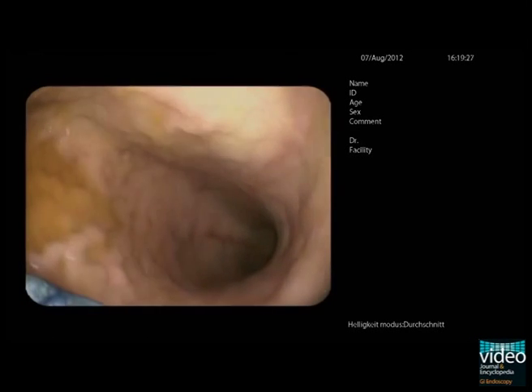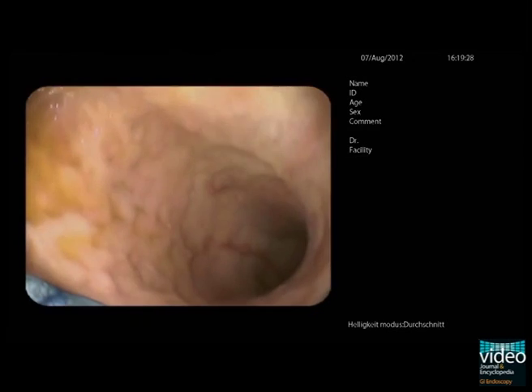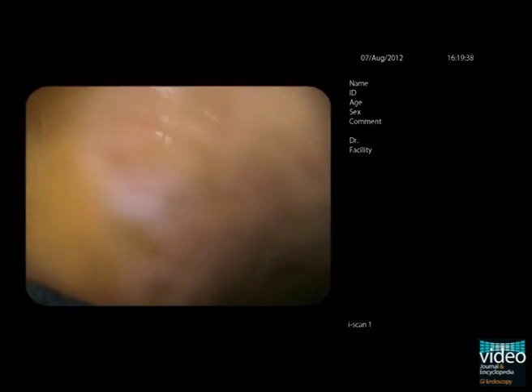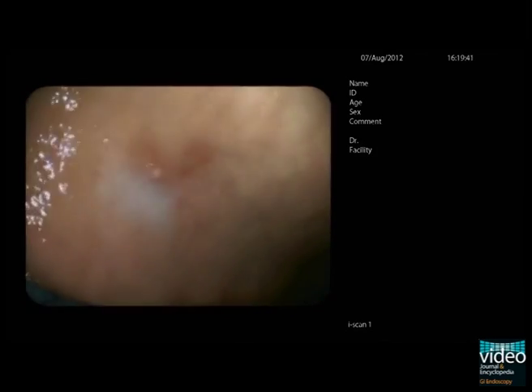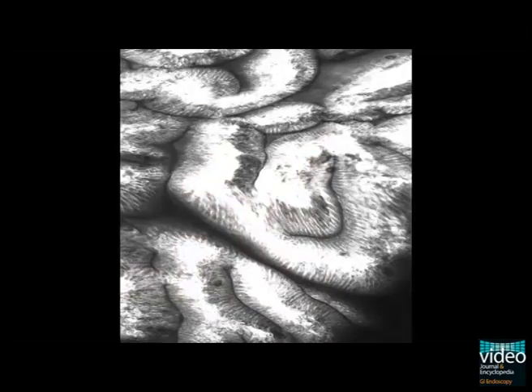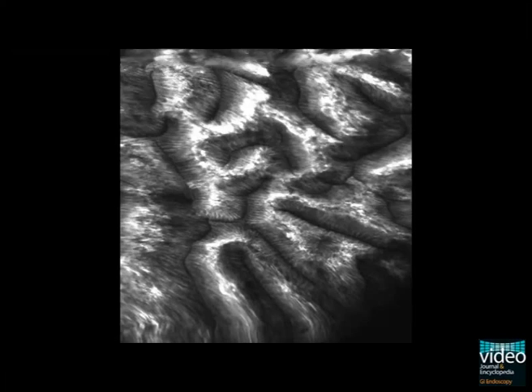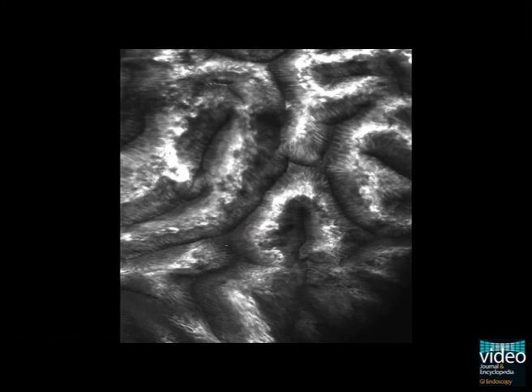In the corpus, reddish lesions are found in the presence of irregular mucosa. One such lesion is screened with endomicroscopy after the injection of fluorescein.